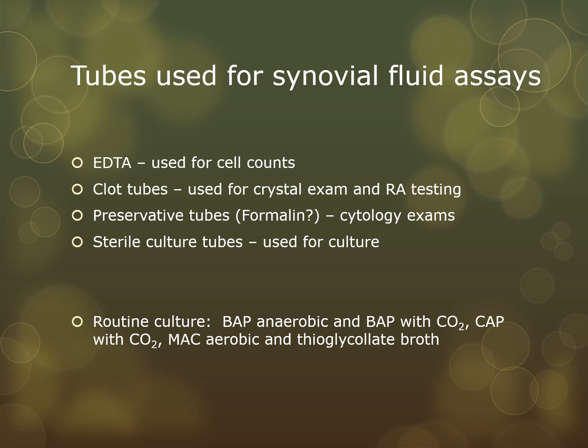And a routine culture for a synovial fluid is just like a spinal fluid and other sterile body fluids. We're going to set up a blood agar anaerobically, a blood agar with CO2, a chocolate with CO2, a MacConkey aerobically, and finally a thioglycolate broth.